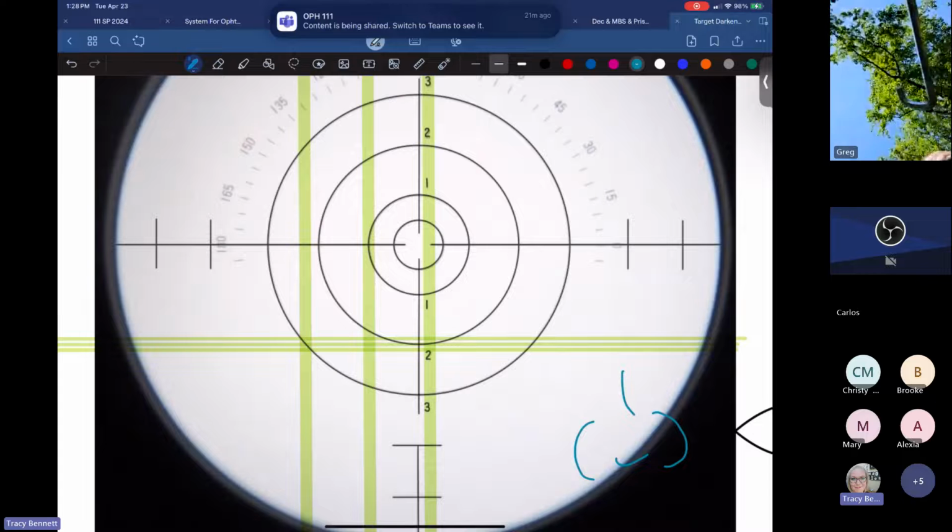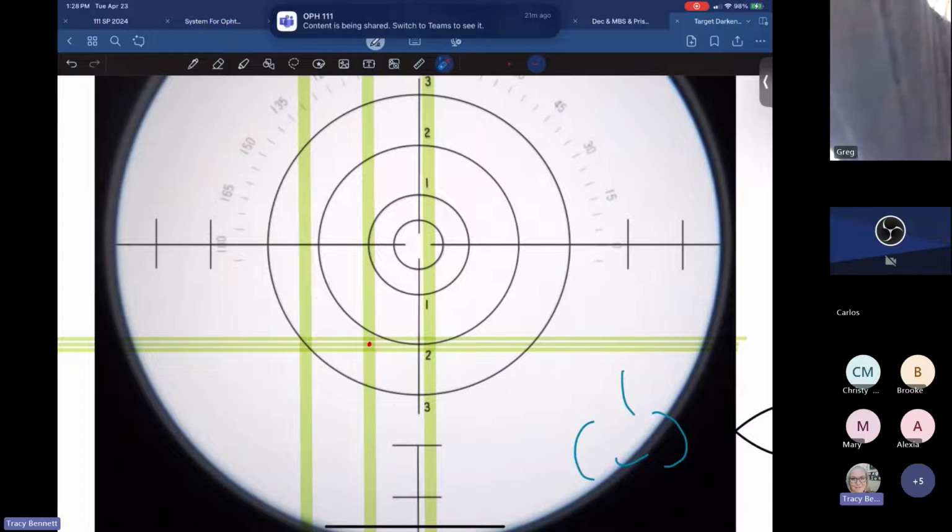So just do your base direction first. Just hammer that one out first because we're looking at this point in particular. And my axis is aligned with the 90 and the 180. So you can use those as a nice little straight line that comes right over here and lets us know that we're at the 2 base down.